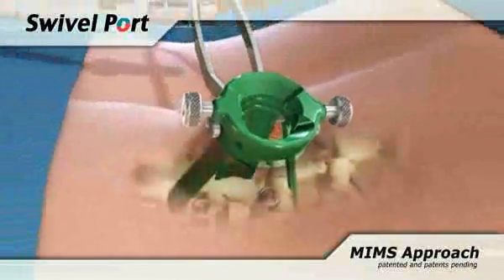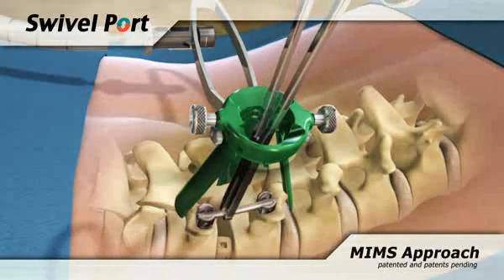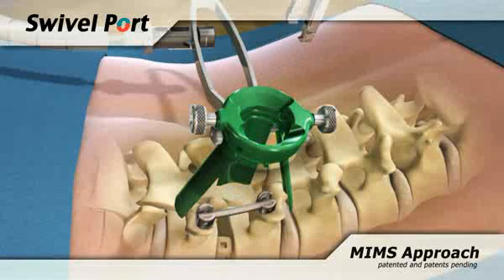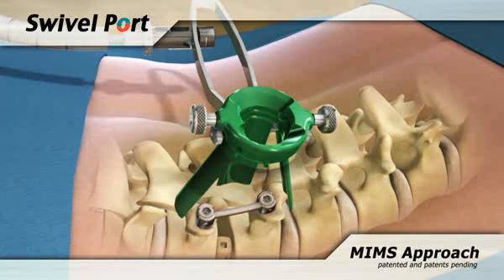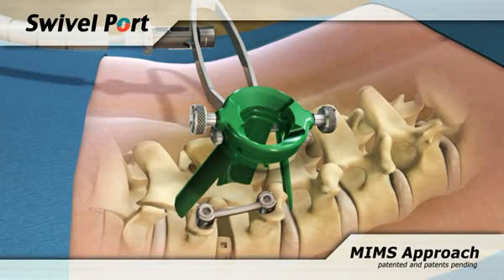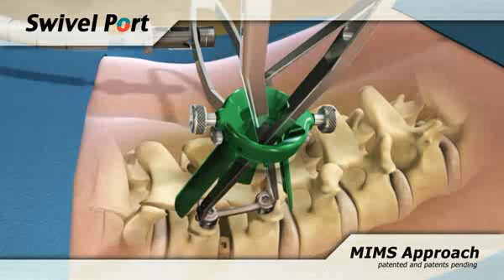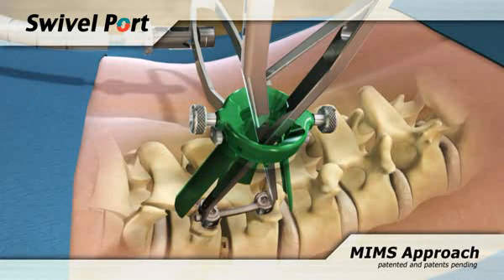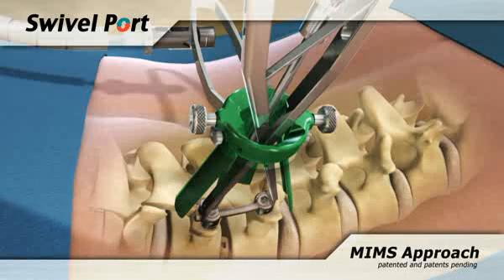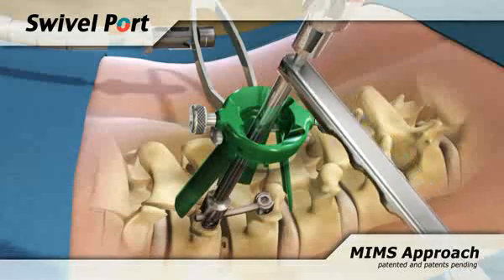With the screws inserted, the rod can then be placed into the screw heads using the pivot-tipped rod forceps. Insert the set screws. Use the anti-torque device and associated hex screwdriver to tighten the caudal set screw maximally. Insert the MIS compressor through the port to compress the disk space. Conversely, the MIS distractor can be used to open the disk space. Once compressed, tighten the rostral set screw using the hex screwdriver. Remove the compressor and insert the anti-torque device and hex screwdriver together to complete tightening of the proximal set screw.